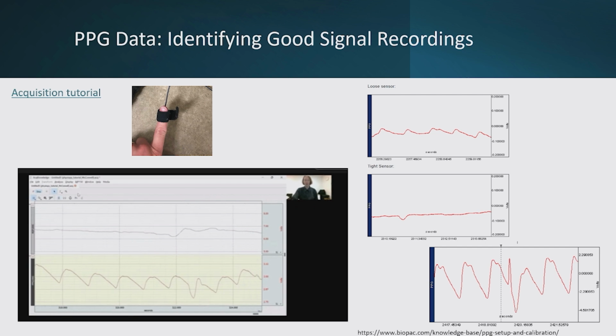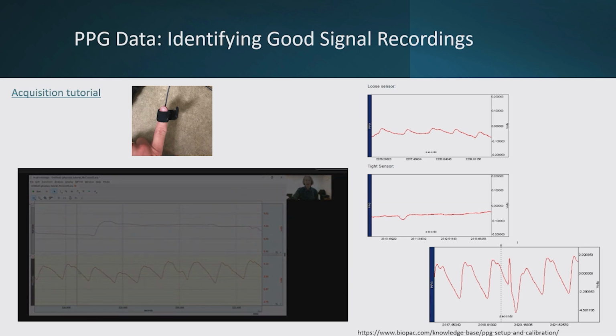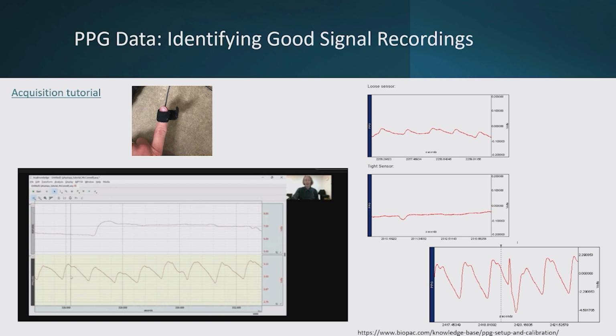So here again, we have a video by Mary Medema in Montreal, and this is her with the PPG system on. Here she's highlighting that's a very good PPG peak. You can see the systolic peak on that first part, and then the dicrotic notch, and then the diastolic peak. So that's a very good example of what you're hoping to capture when you're looking at your PPG data.